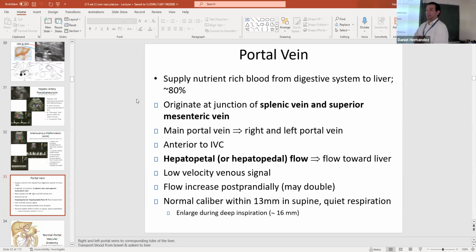I've seen a couple of board questions about that. I remember you telling the second years. So what study would that technically be? I would say if you were scanning and they wanted to rule out portal vein thrombosis, and the flow was so slow that even power Doppler didn't pick it up, after they've eaten that might be enough to increase flow volume to allow you to visualize the main portal vein as being patent.